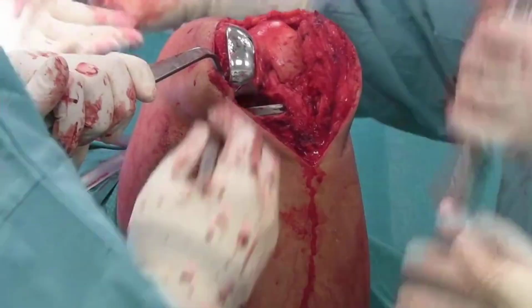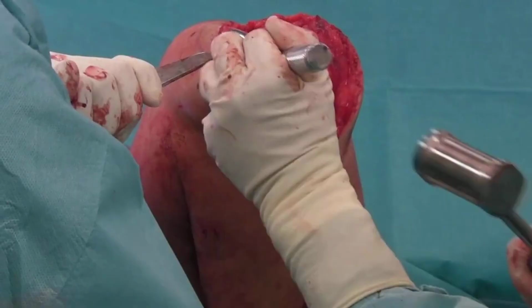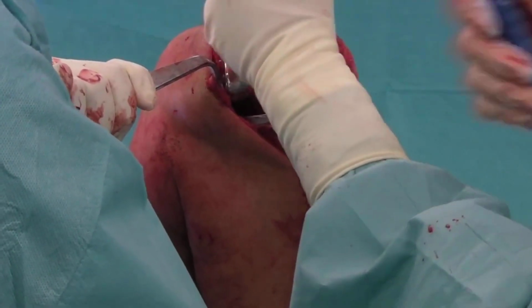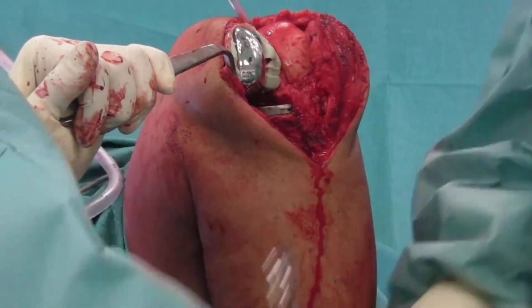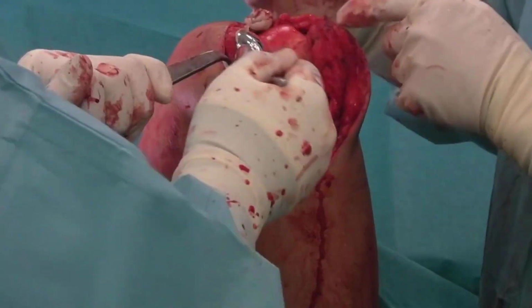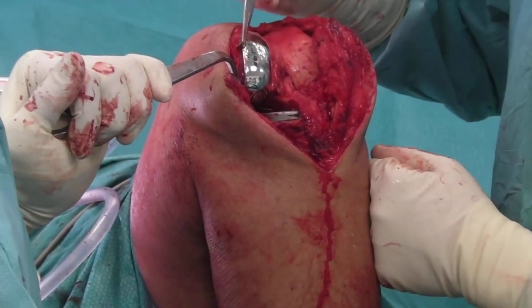After inserting the prosthesis with the cement still soft into the housings we have previously prepared, we tap the metal components to ensure perfect adhesion of the prosthesis. The soft cement that comes out due to the pressure we have exerted will be completely removed before it hardens completely over the next few minutes.